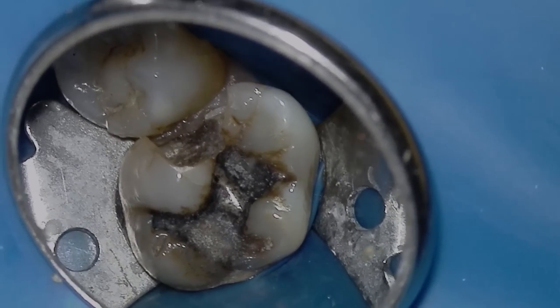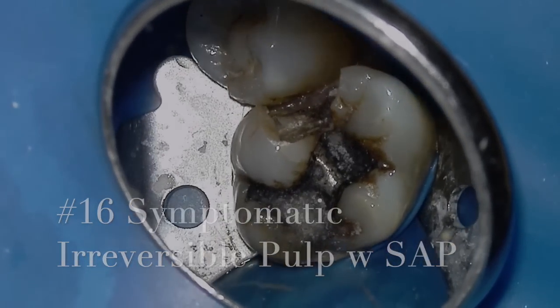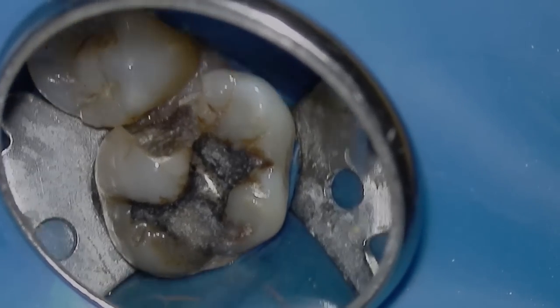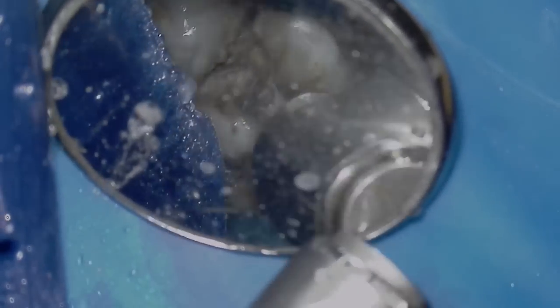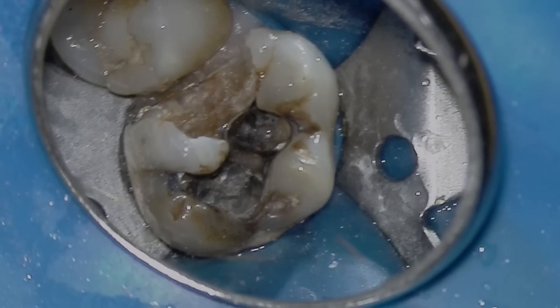This patient, a 55-year-old female, presented with a lot of pain to hot and cold and biting pain. We diagnosed her with symptomatic irreversible pulpitis with symptomatic apical periodontitis. We removed all the decay and the undermined enamel, and that's what we were left with.